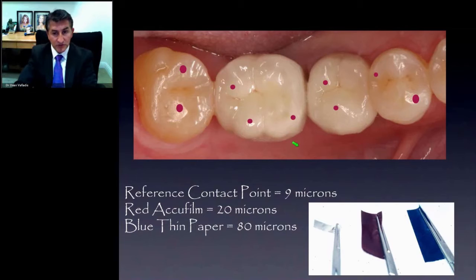So depending on what you consider to be light occlusion, that will vary for different patients. We also know that the depression of a second molar is a lot greater than the depression of a first premolar, so that may take effect. I think what we all want at the end is a centric position here, light occlusion for me at 20 microns slipping through, so that if there's depressibility, the implants come into contact there.